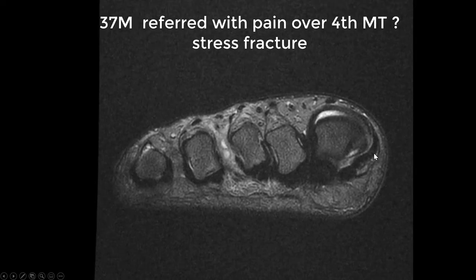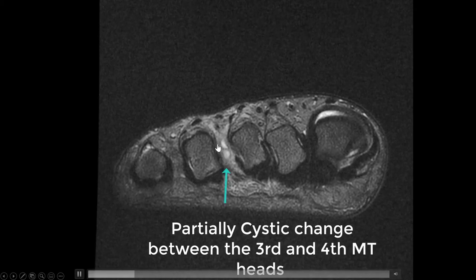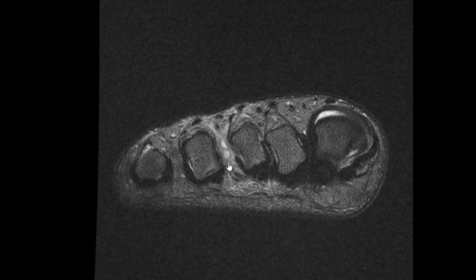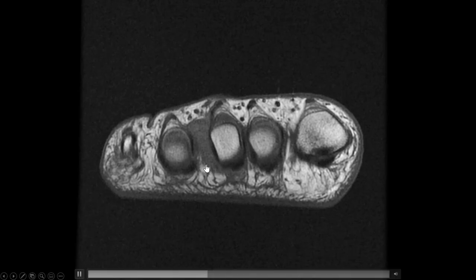This is your chance now to test yourself. So have a look at the MRI. I'll point out some cystic change. You're seeing a series of patched together videos. So there's low signal now on the MR axial view.